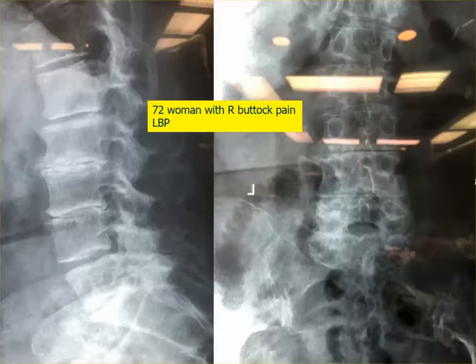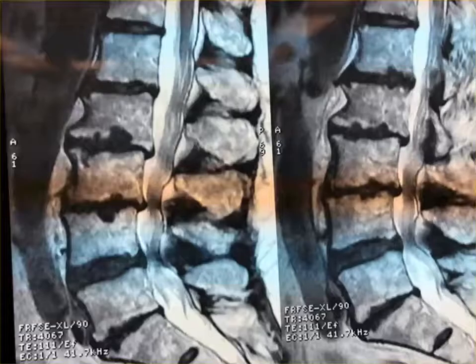Okay, so some decreased disc height at every level. This is sagittal cuts on the MRI. Come closer and talk to the microphone. Same thing. Now you see the 4-5 disc looks pretty normal, right? Mild bulging, but the discs, you can see they're deteriorated and decreased in height. 2-3, 3-4, L5-S1.